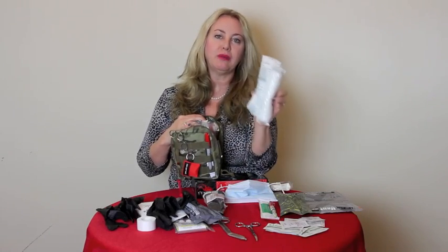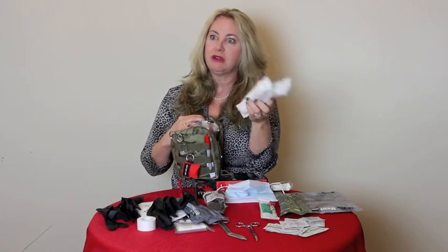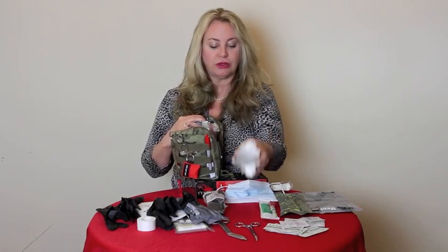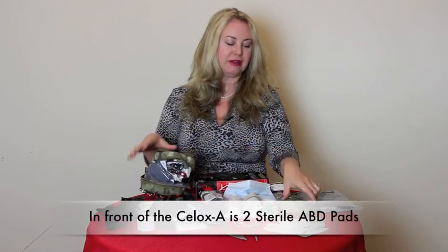Next to the tourniquet, you have the roller gauze. These are sterile. They can be used to pack a wound. They can be used for compression. They can be used after you're done to actually dress a wound. So you have lots of gauze in here. Behind that, you've now got your Celox A.